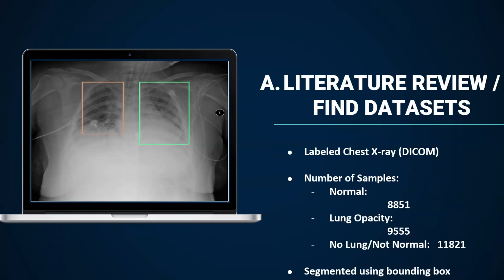The dataset contains nearly 27,000 images, where each one is labeled either not normal, no lung opacity, normal, or lung opacity. Normal label represents neither pneumonia nor any other conditions detected in the image. Not normal, no lung opacity represents opacity in the X-ray image caused by a condition other than pneumonia. Hence, it is related to any other conditions. Finally, lung opacity represents opacity in the image caused by pneumonia. Opaque areas are segmented by radiologists using the bounding box technique. Distribution of the labels is shown here.